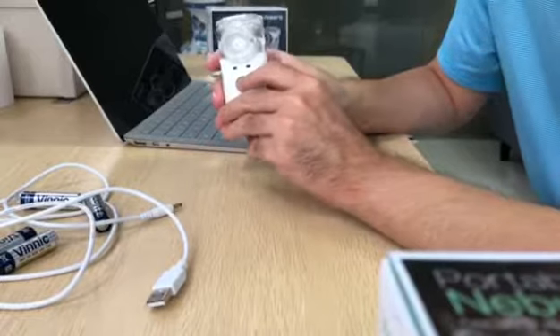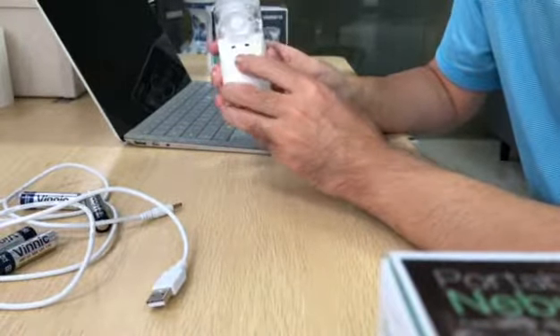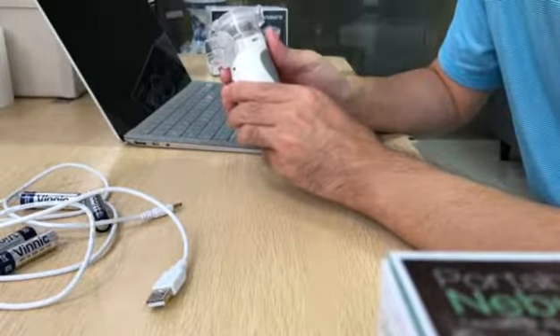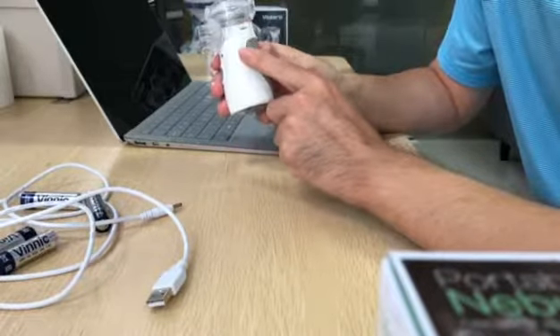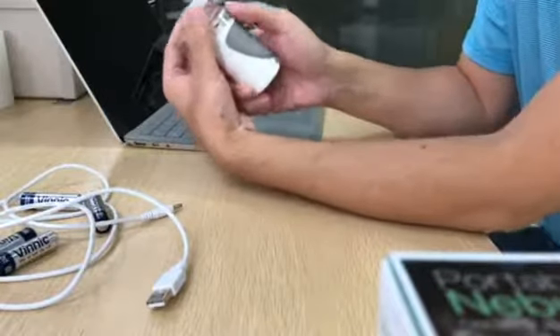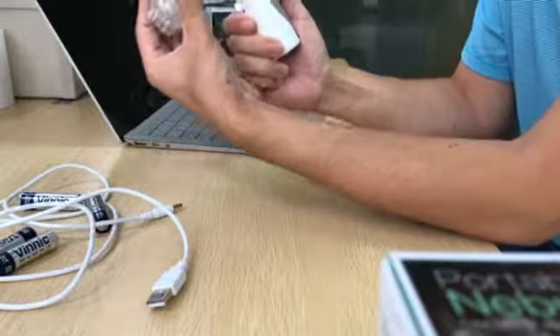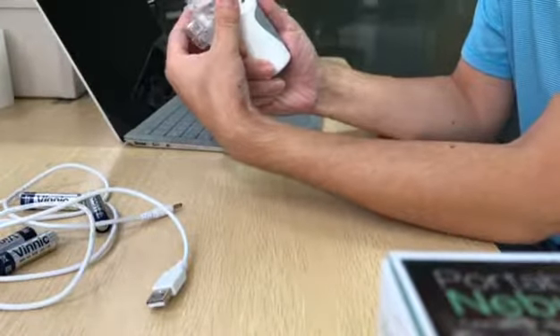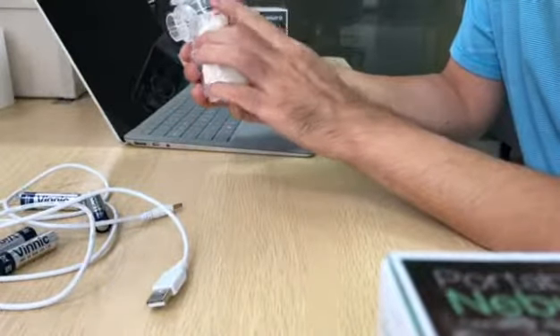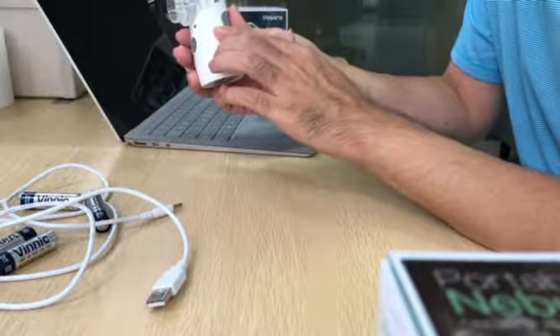Now we show how to troubleshoot the nebulizer if it cannot work for you. First of all, you can confirm if the cap has a full connection with the nebulizer. Press this button. Take out the cap module. Reconnect it. You can hear a click. This means the cap module has a full connection with the nebulizer.